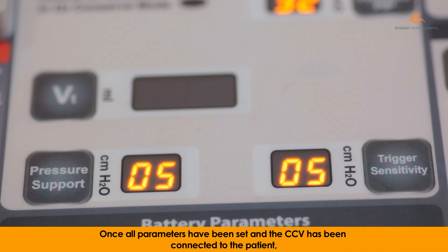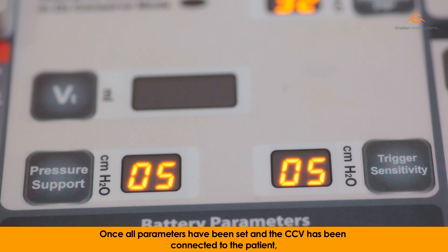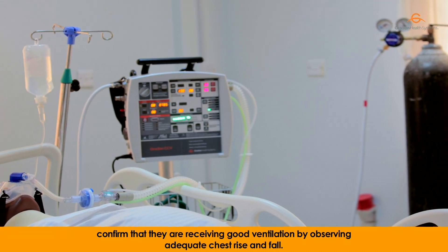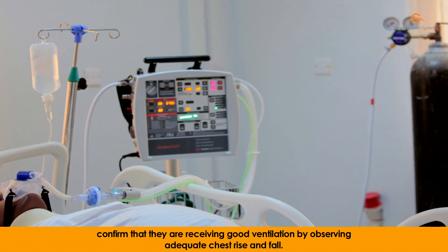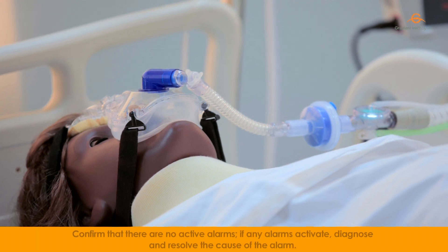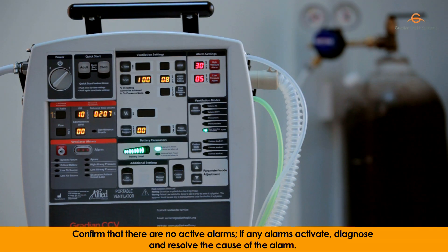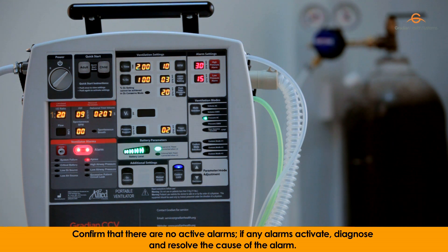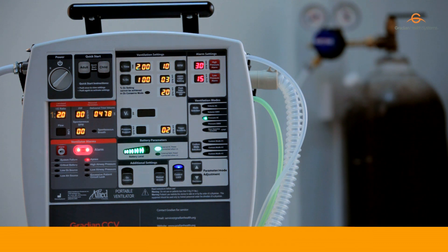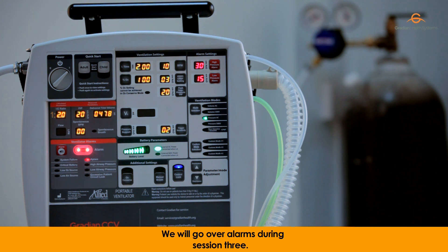Once all parameters have been set and the CCV has been connected to the patient, confirm that they are receiving good ventilation by observing adequate chest rise and fall. Confirm that there are no active alarms. If any alarms activate, diagnose and resolve the cause of the alarm. We will go over alarms during session 3.